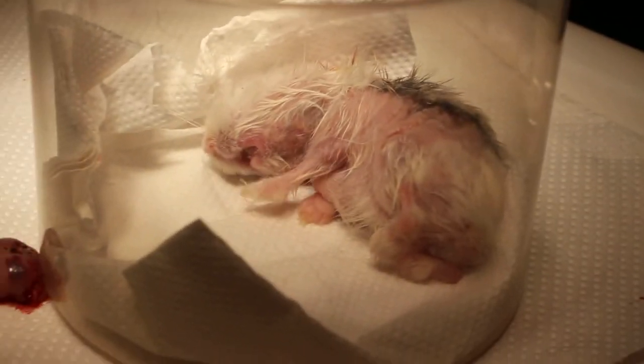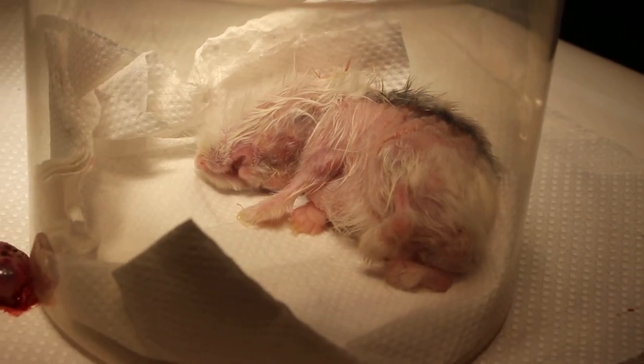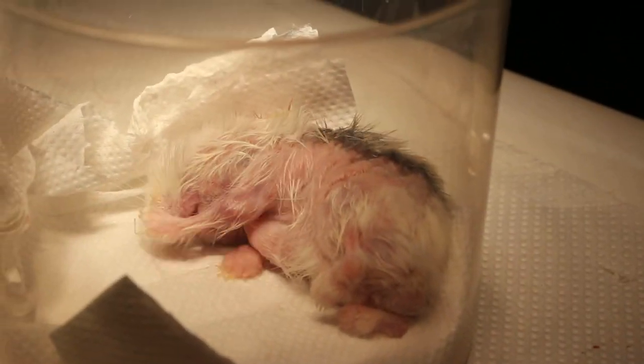So you can see the hamster is still groggy, but it should be able to wake up soon. That's the end of surgery three.